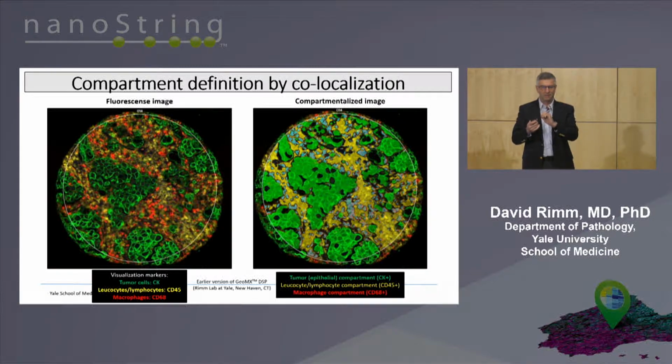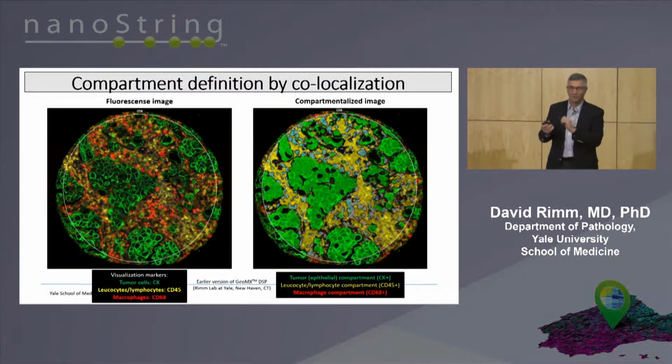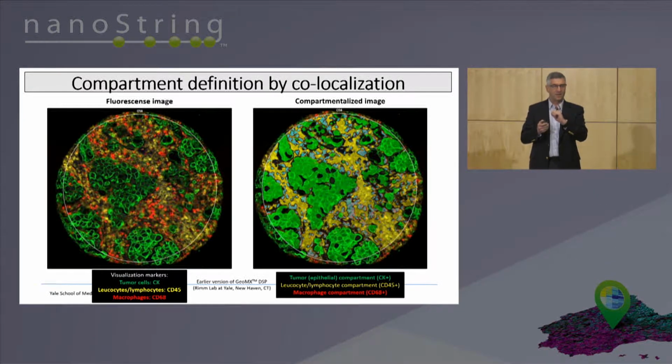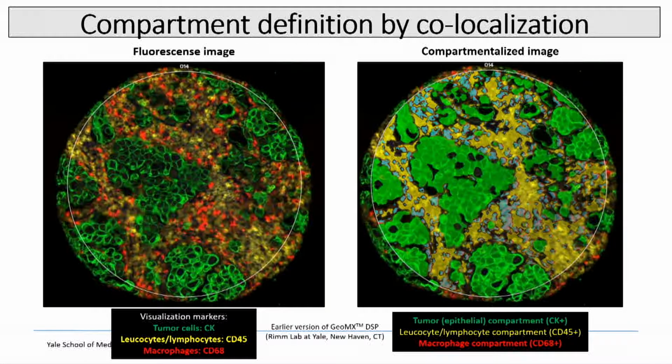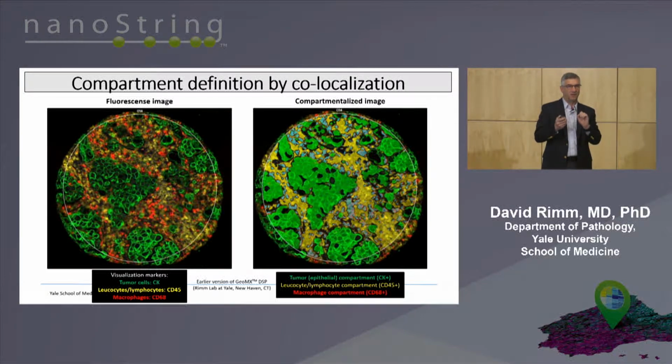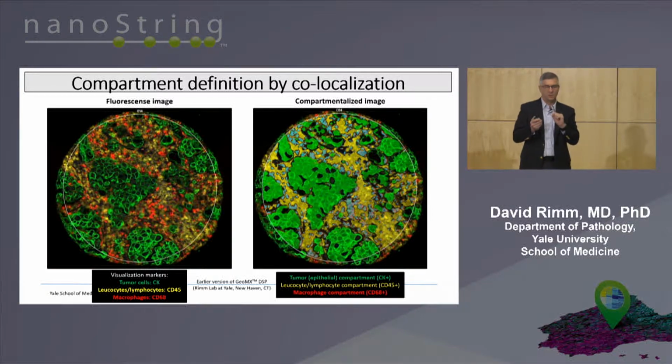And it's hard to really fully appreciate this, especially without a pointer here. But I think that you can see that the cytokeratin, for example, which looks predominantly cytoplasmic and membranous in this appearance, creates a mask under which we can sip up all the counts that are related to the cytokeratin, but it isn't perfect. That is, if there's a few lymphocytes in there, they might get sipped up as well. And so we're talking about a regional generalization as opposed to a specific cellular entity that this tool can do.